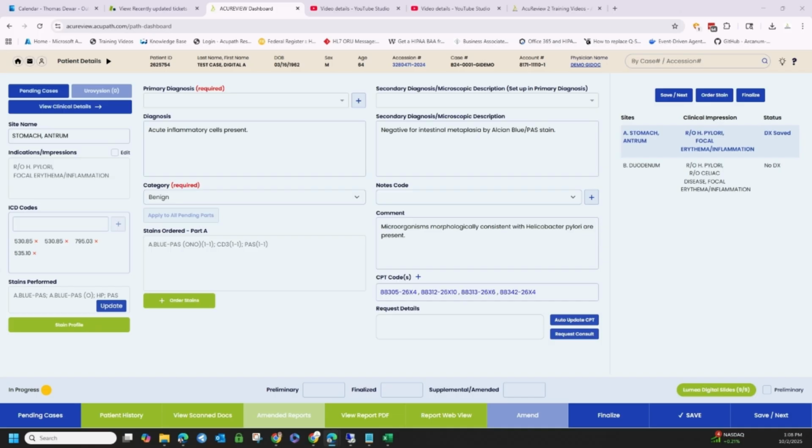So initially you fill out a form to sign off that this is what you want as your upfront stain profile, if you want one. And then we now give you in AcuReview 2 a way to view that, because in AcuReview 1 there was no way to see that stain profile unless you asked for a copy of it. So now at any time you want, you can see the stain profile. And if something looks wrong with it, you can suggest changes as you want.